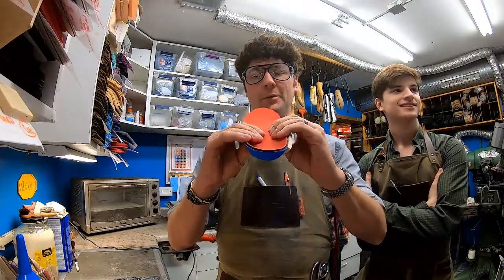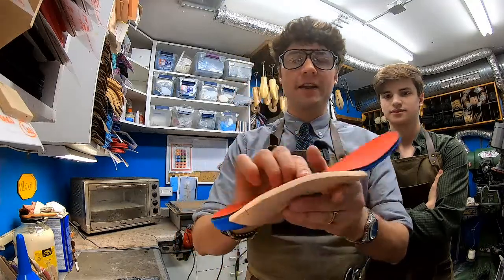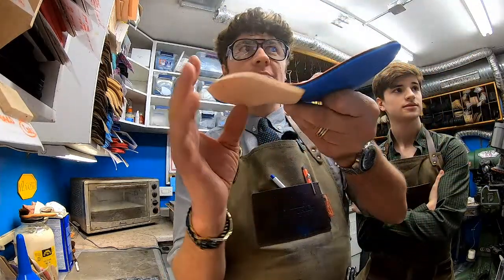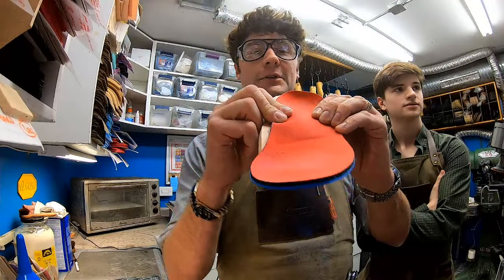So we got this 6 mil P-cell. We're going to really help offload this spot. Now I soften that area up, and we want to make sure that if we don't support this midline here, that pressure is really going to collapse. So we want to make sure that we fill that area out.